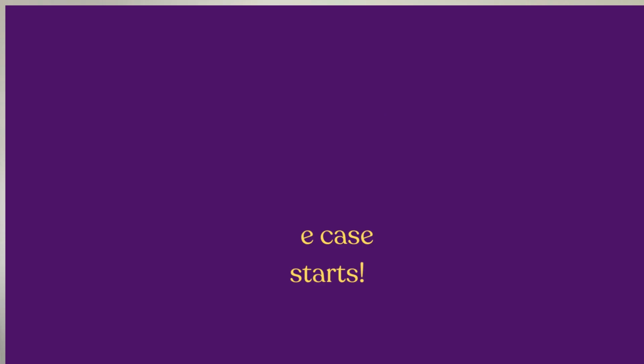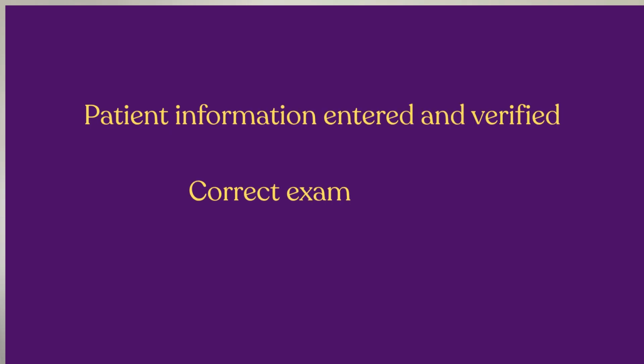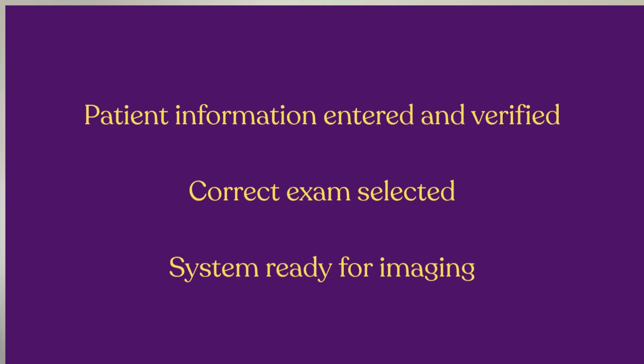Most mistakes in the OR don't happen during imaging. They happen before the first image is ever taken. Set yourself up before the case starts. The OR is not the place to figure things out as you go. Proper setup means completing all your workstation tasks before the surgeon is ready to begin. Patient information is entered and verified, the correct exam is selected, and the system is ready for imaging.